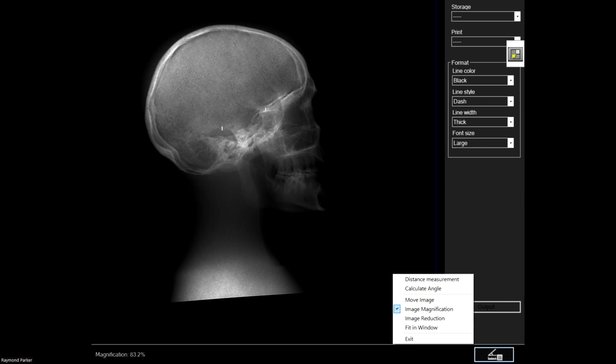At that point in time, I want to measure something. Generally, this is going to be used clinically at bedside by a physician's assistant, nurse practitioner, or surgeon, and they've placed, say, an endotracheal tube and they'd like to measure to the carina. How far did they advance, or is it in the proper position, that endotracheal tube?